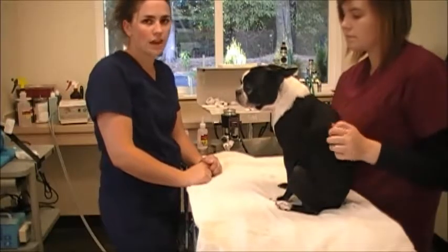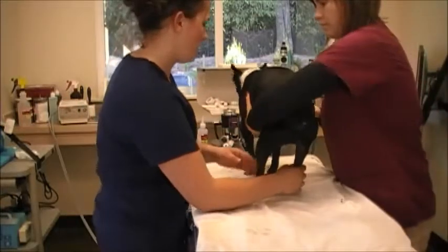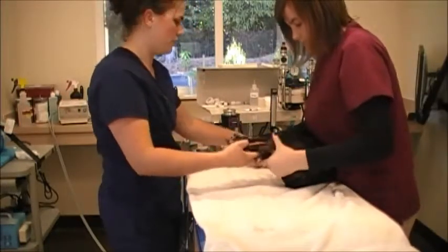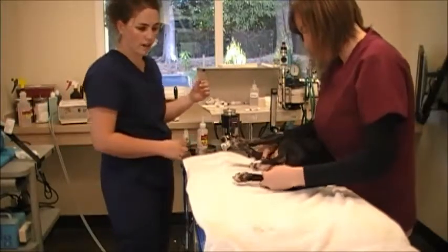For a stable patient, it's ideal they can be lying in a right lateral recumbency, on the right side. If the patient's not stable, you can just do it standing. But we're going to do this with minimal stress to the patient at all times, making sure that they're not in any respiratory distress or cardiac distress.